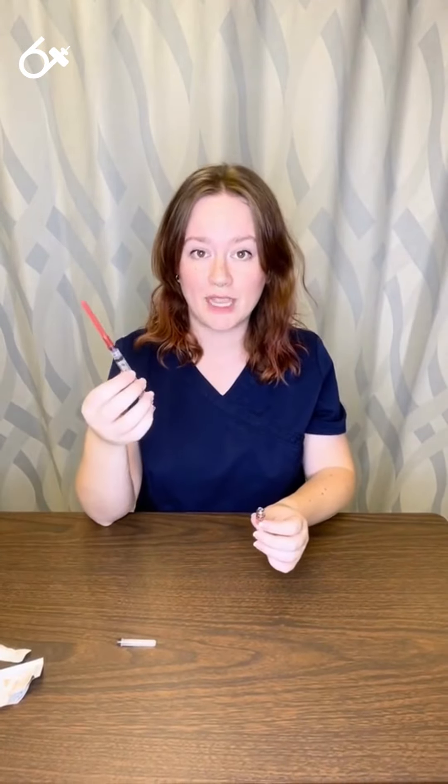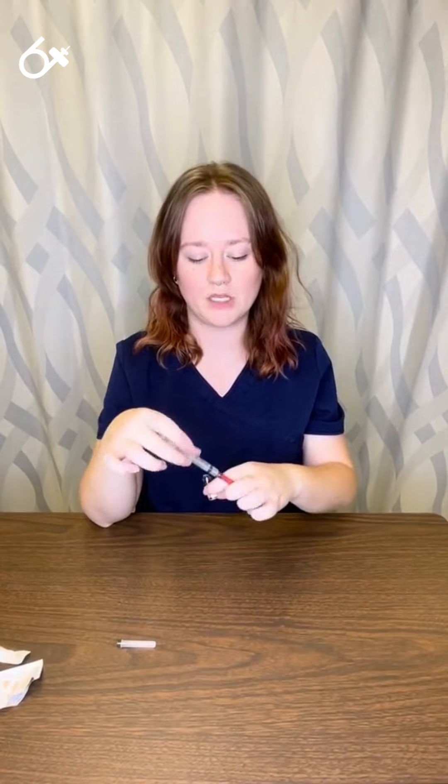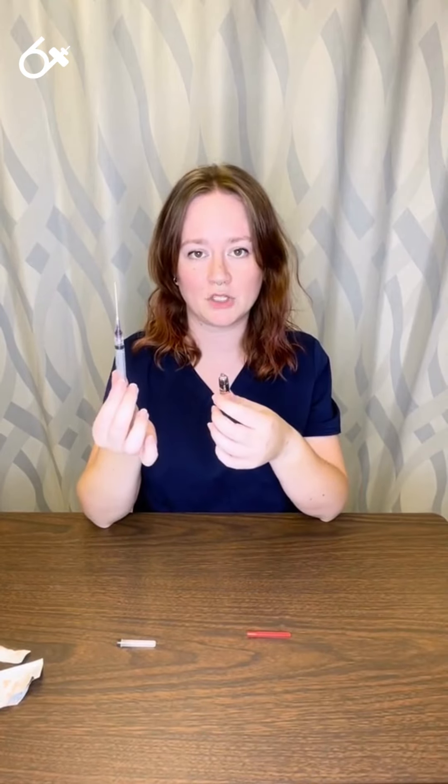To get the medication out of the ampule, I need a needle with a filtered syringe. This filtered syringe is going to make sure that none of the glass particles that may have fallen into the medication when I popped the top off are going to be drawn up into my medication itself.